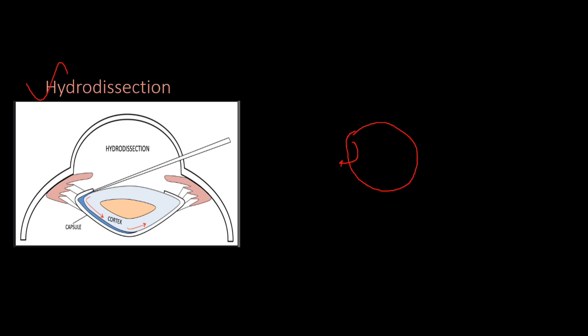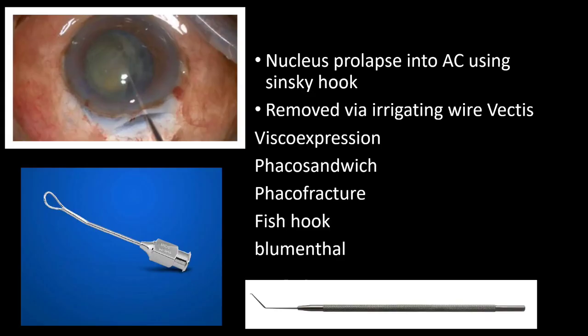We remove the anterior capsule using a cystitome or a 26-gauge needle with double angulation at the tip as well as near the hub. After entering the anterior chamber through the sclerocorneal incision, the next step is hydrodissection. We inject balanced salt solution to separate the capsule and cortex from the nucleus.